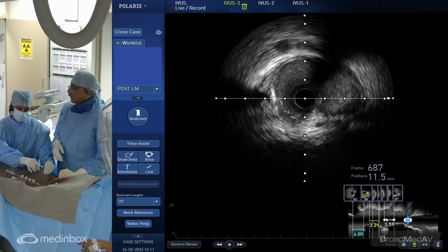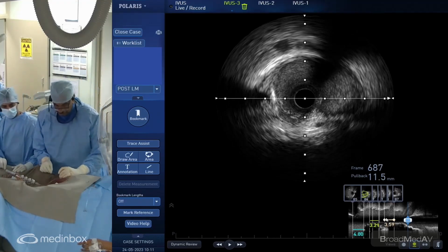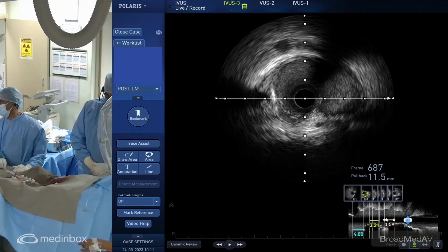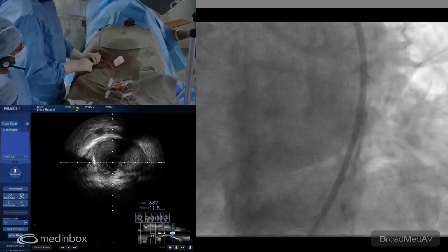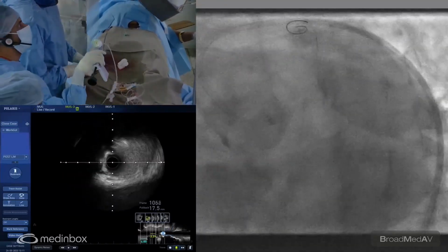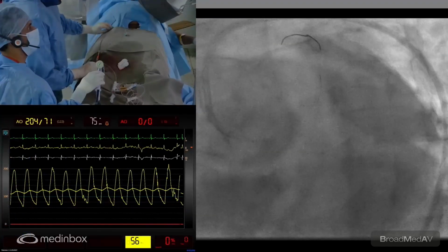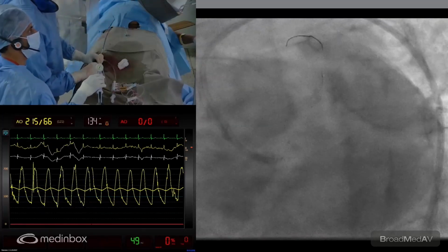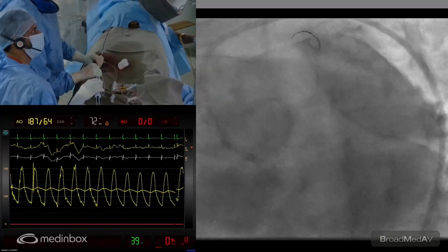And I think the reason is that as the stent straightens at an acute curve, the stent will move back. Though I was putting pressure, it would do that. But anyway, let's go to the LAO caudal, please, again. So I'm floating the guiding. We should not have it anywhere near the stent. Another interesting thing is the length of the stent in the IVUS is exactly 12. So it neither elongates nor shortens after deployment and post-dilatation.